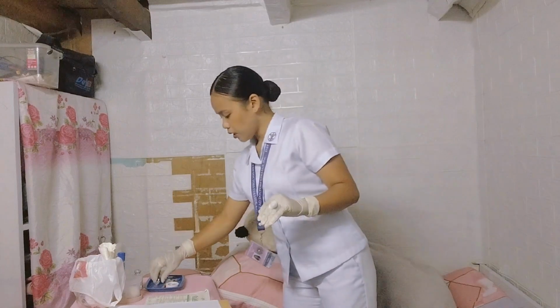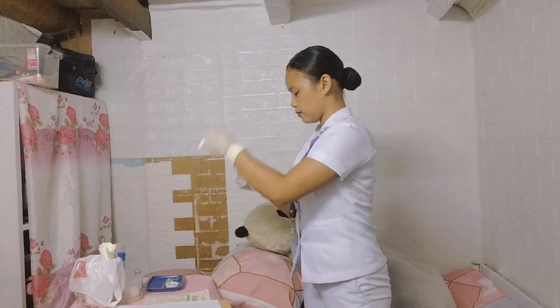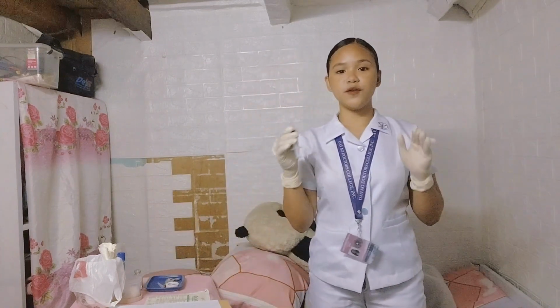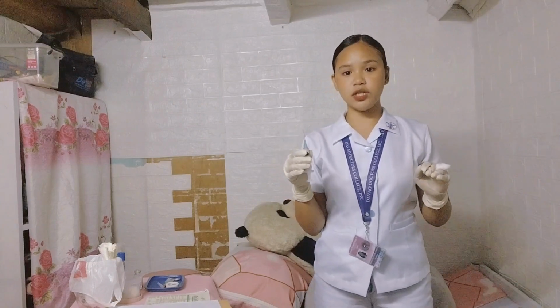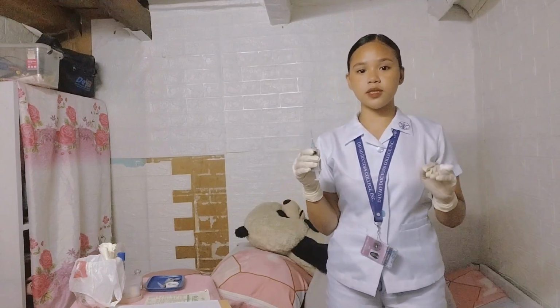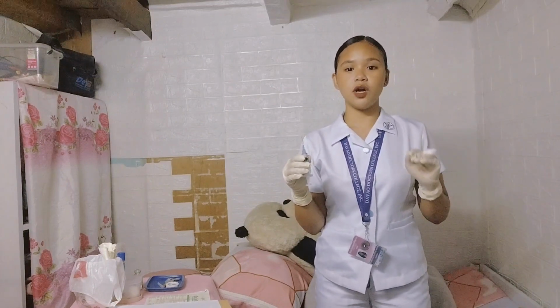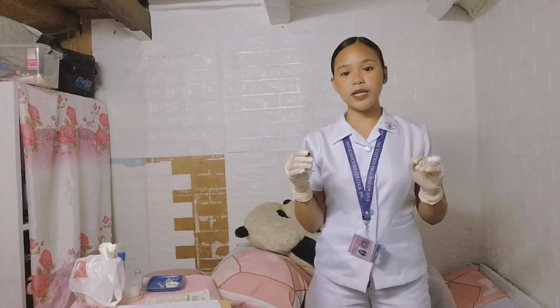And now get the needle, and remove the needle cover. If using a prefilled unit dose medication, take caution to avoid dripping the medication from the needle prior to injection. If this does occur, wipe the medication off the needle with a sterile gauze, because medication left on the needle can cause pain when it is tracked into the subcutaneous tissue.